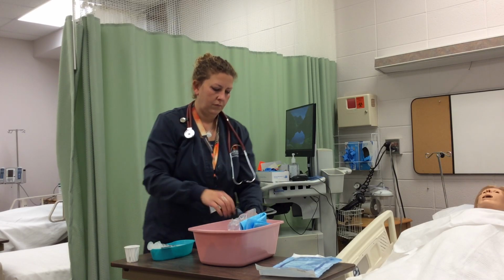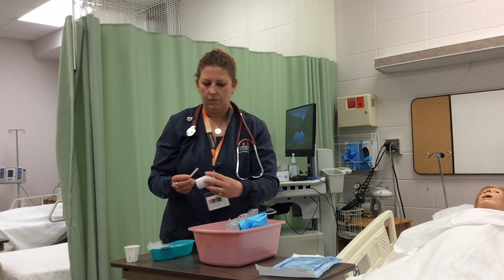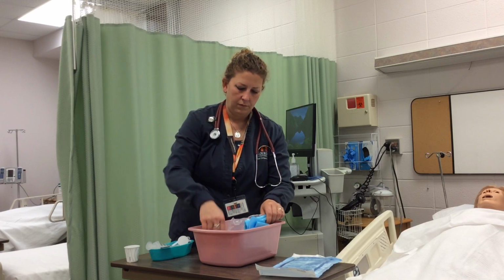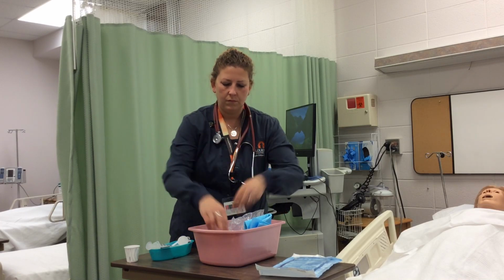You can use just regular tape to secure it. pH strips, pulse oximeter, and vital signs equipment, and oral hygiene supplies.